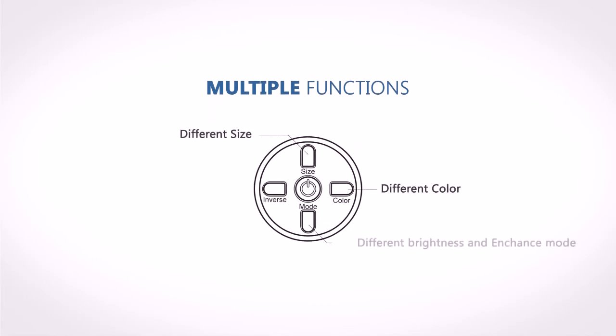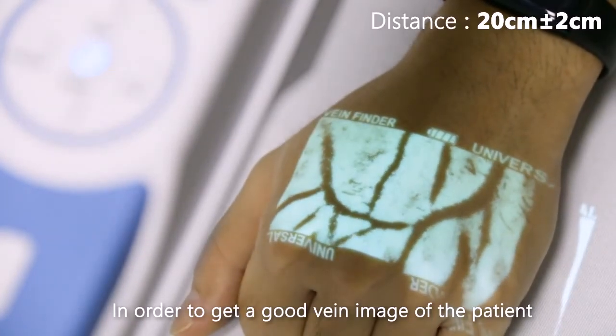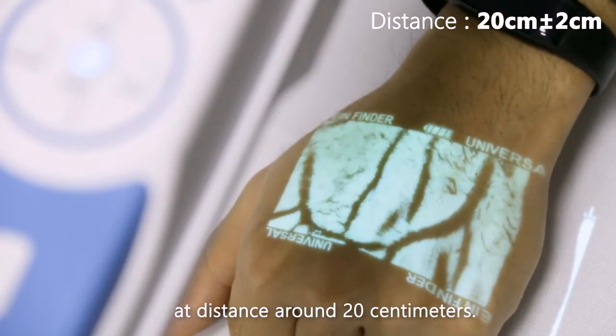The VS 400 has multiple functions: different color, different size, different display mode, and inverse mode. In order to get a good vein image of the patient, we must keep the distance between the imaging unit and the skin at around 20 centimeters.